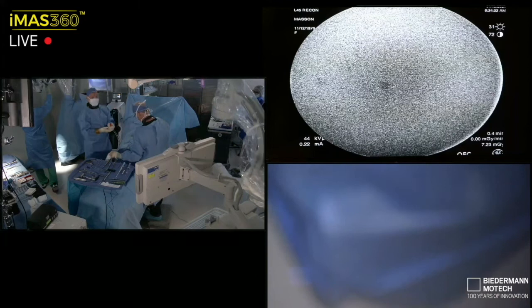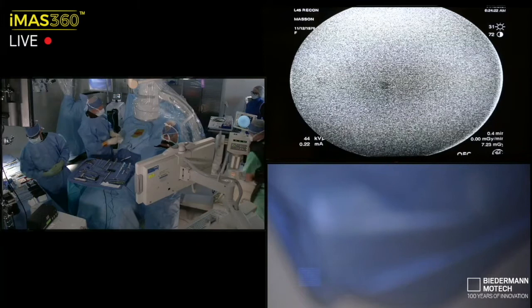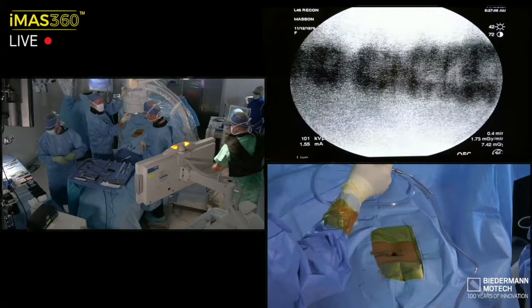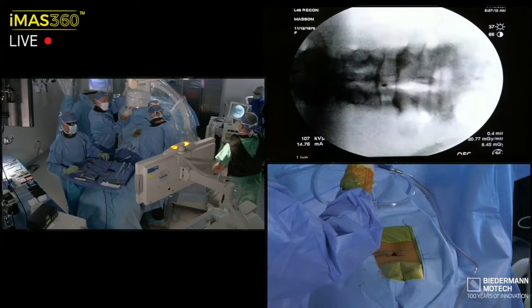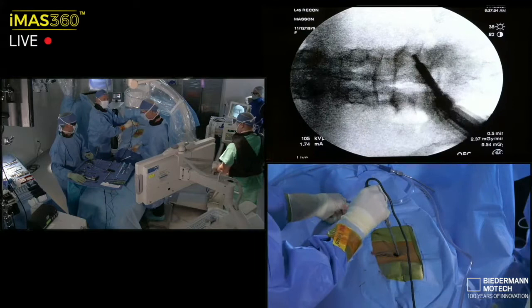And yeah, I'm still in the image-guided fluoroscopic screw placement zone. Have not migrated to nav robotics. This is still easy and efficient and extremely, extremely accurate for me. And I still consider screw placement the easiest part of the case. So I'm not a big fan of expensive enabling technologies for the easy part of the case. But obviously those options are available should it be necessary.